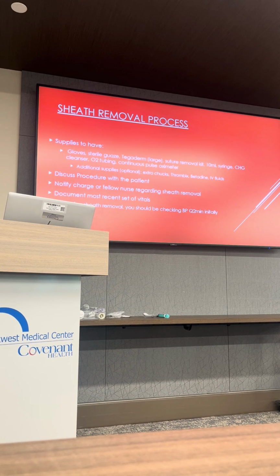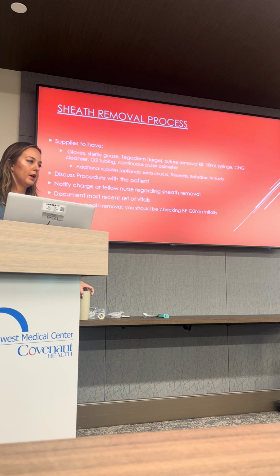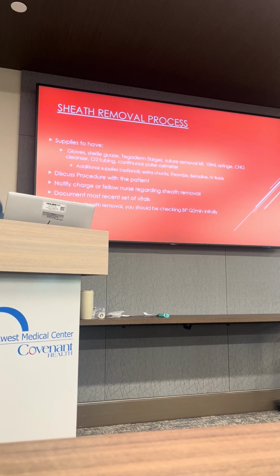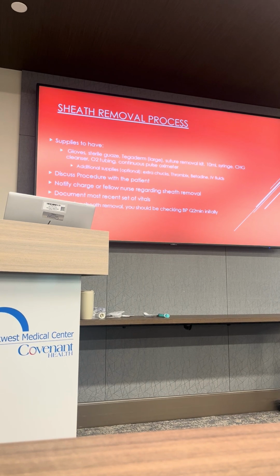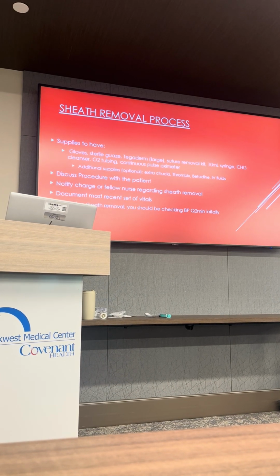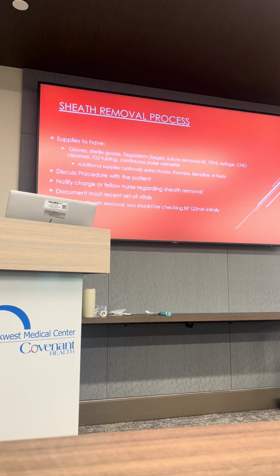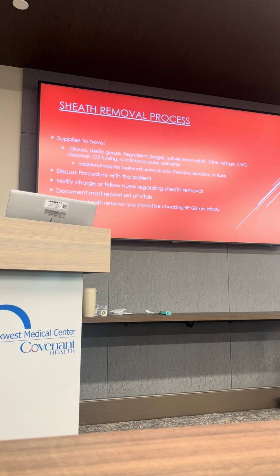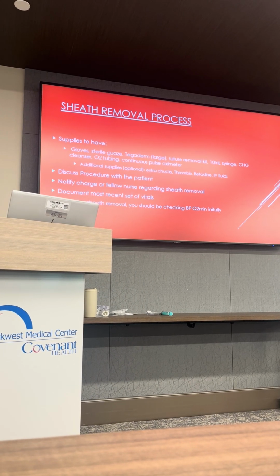The big thing that we want to do is make sure that the patient's completely aware of what this process looks like. It's a good rule of thumb to discuss this prior to even getting started with the procedure. You want to be completely transparent about what they need to expect in regards to bed rest, and that this is going to be uncomfortable. If we are concerned that they're not going to be able to tolerate it well, there are often times where we can give some medicine to make patients more comfortable, but that needs to be pre-planned ahead of time. You don't want to be in the situation where you're holding pressure on a groin, having to yell out in the hallway, asking people for additional assistance for meds and different things like that.